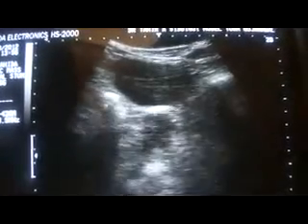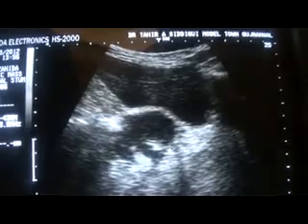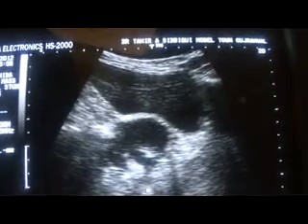The cyst does not change its shape while I am moving the probe. It retains its shape. Secondly, you can see that it gives posterior wall enhancement, or strong back wall, or acoustic enhancement. You can see this area behind the posterior wall of the cystic area — this is the fluid compartment, and these are the echogenic areas.